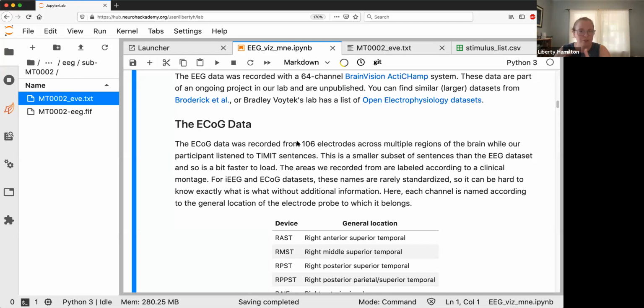The way that our research fits into this is that while the patients are in the hospital being monitored with these electrodes, we might go in and ask them if they would be willing to read some sentences, or we're trying to make more fun tasks with the iPad that are a little bit more game-like, or more interesting little video clips that people can listen to. And if they feel like doing it, then we will record with our equipment and include this stimulus synchronization through the TDT system. And if not, then we go.